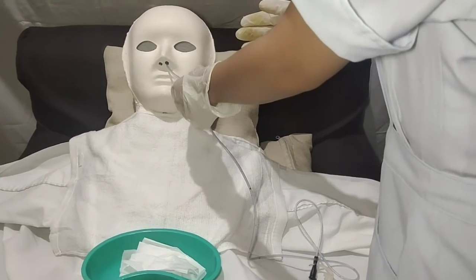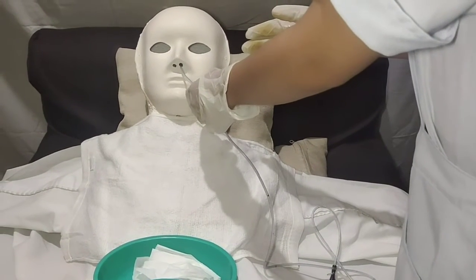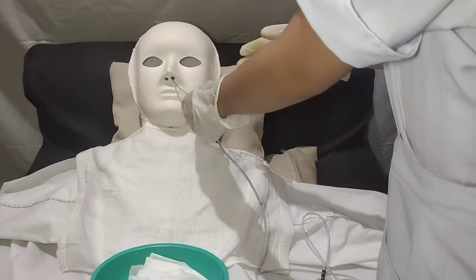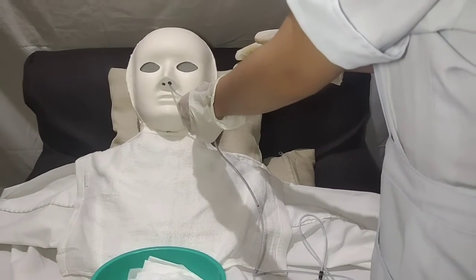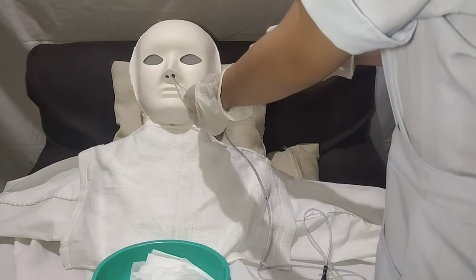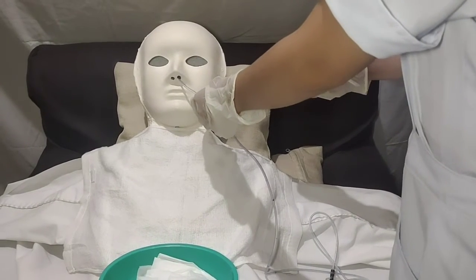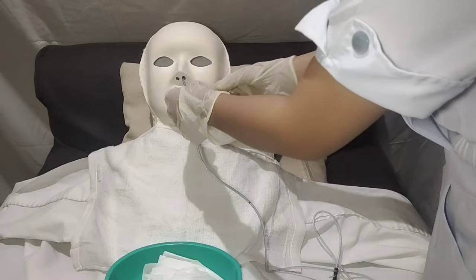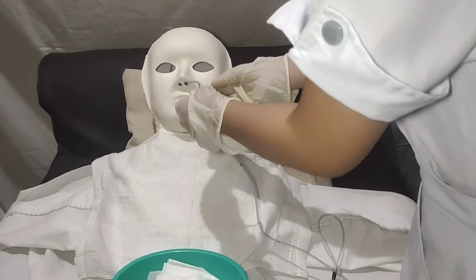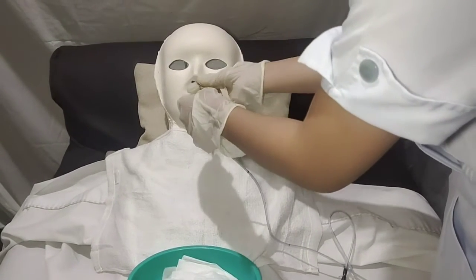Stop when patients breathe. If gagging and coughing persist, stop advancing the tube and check placement of tube with tongue plate and flashlight. If tube is curled, straighten it and attempt to advance it again. Keep advancing the tube until pen marking is reached. Do not use force; rotate tube if it meets resistance. Ma'am, would you touch your chin to chest and sip water then swallow?